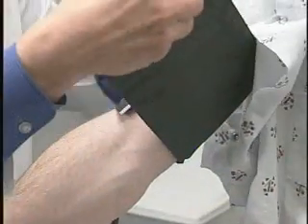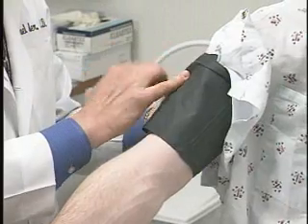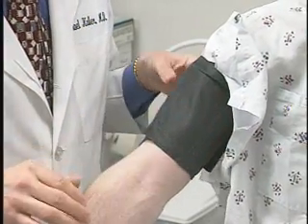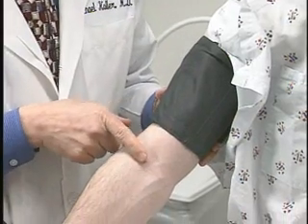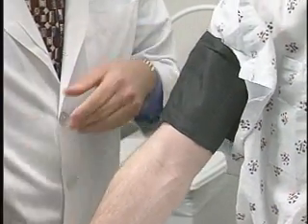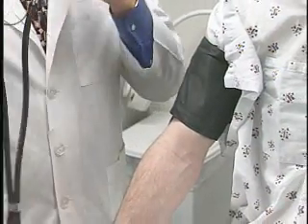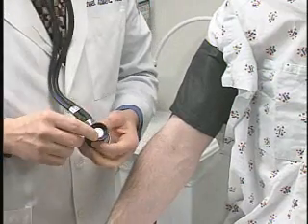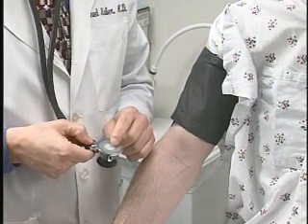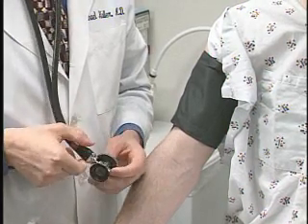So a normal adult cuff fits that just fine. Go ahead and place the blood pressure cuff snugly on his arm. You'll notice I'm approximately 2.5 centimeters above the antecubital fossa. Bates will recommend that you check the blood pressure with the bell of your stethoscope, but I think you'll find most physicians at Loyola use a diaphragm to measure blood pressure.